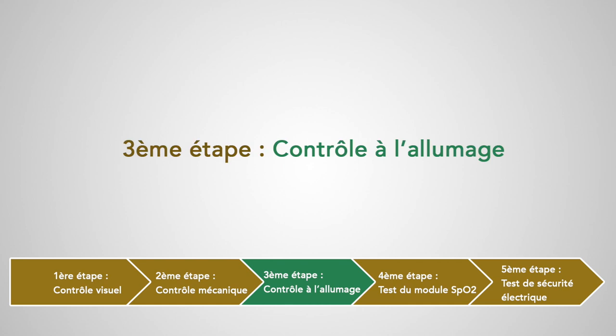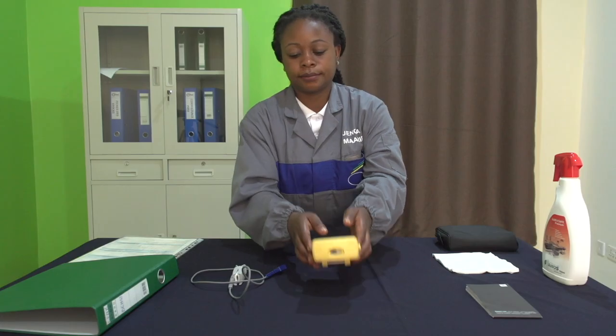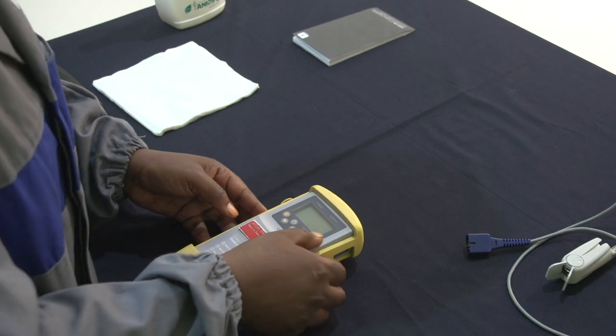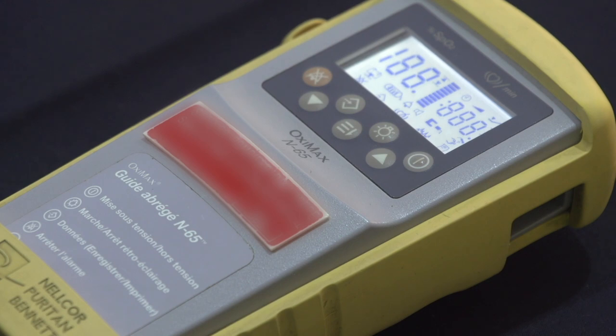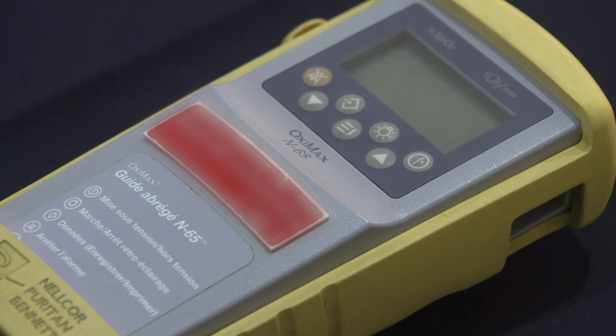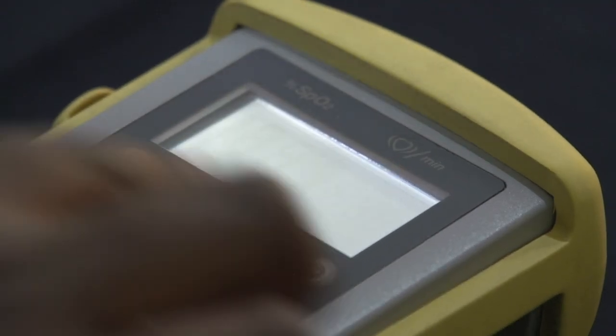Troisième étape : le contrôle à l'allumage. Auto-test. On va allumer l'appareil et vérifier que tous les voyants et les bips sonores se déclenchent. On vérifie l'état de l'écran, c'est-à-dire s'il est en bon état, s'il n'est pas cassé et si les inscriptions qui s'affichent sont visibles. Ensuite, on vérifie le fonctionnement de tous les boutons de réglage.